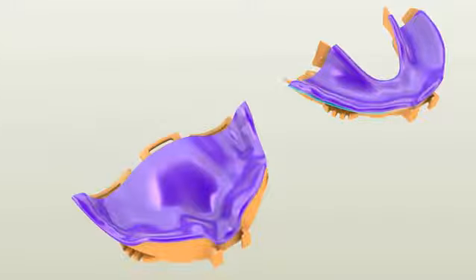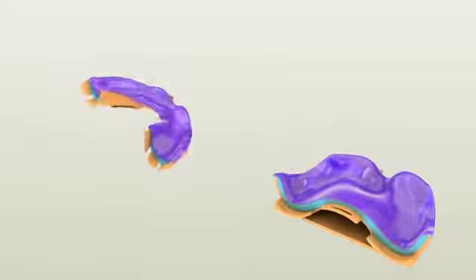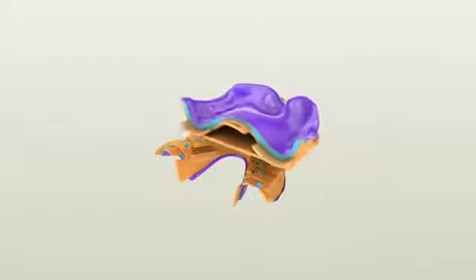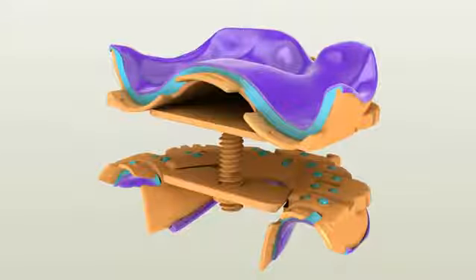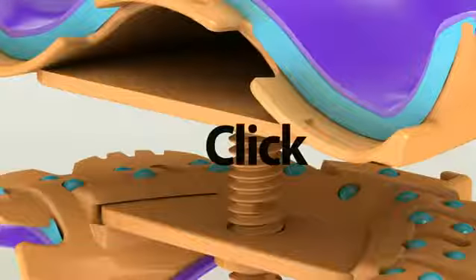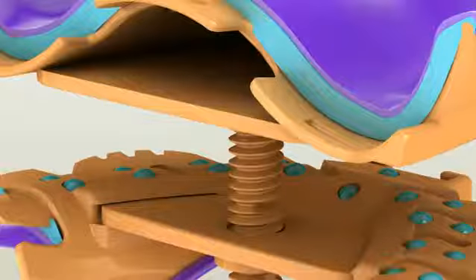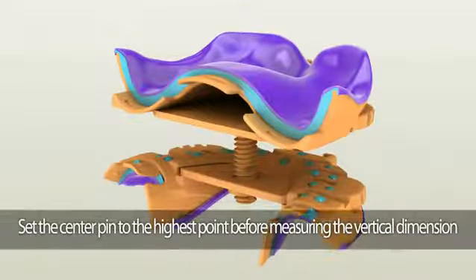After cutting and separating the posterior parts, trim the excess impression material covering the outer surfaces of both trays — this will help with loading the bite registration material later. To assemble the built-in intraoral gothic arch tracer, first insert the center pin holder into the mandibular tray with the bevel facing downward until you hear a click. Then gently screw in the plastic center pin, making sure the pointed part aims upward.